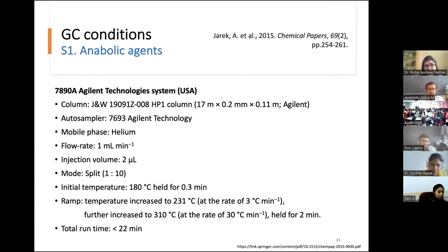Injection volume is very little in a GC. If you've seen a GC vial, it's very small. So what we used to do at NDTL, we used to process at least 50 to 70 samples per day. Okay, that was routine testing every single day. We used to prepare those samples, put them in vials, and send them to GCMS instrument for analysis.